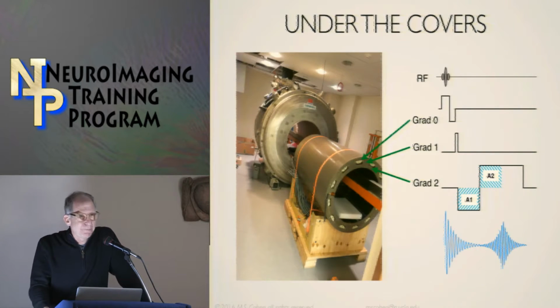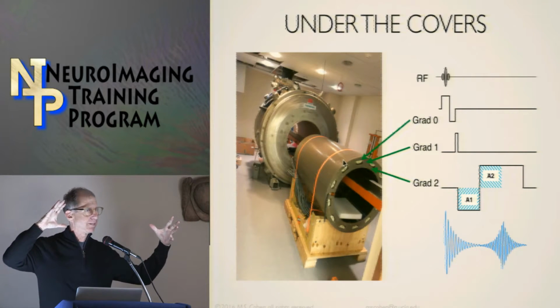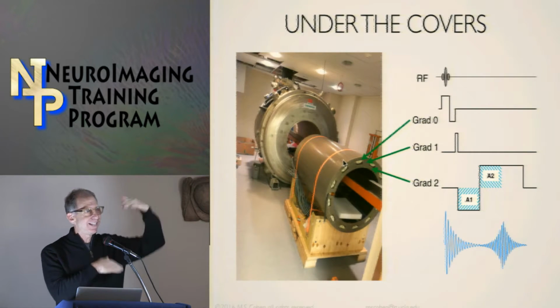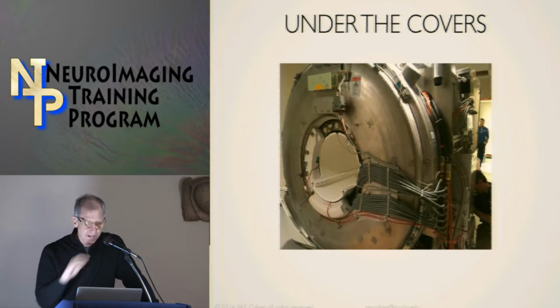Then start peeling things apart a little further, and you can see the actual magnetic resonance imaging field gradients, which are these giant coils of wire made to make the field vary with position. They're wound concentrically, X on the inside, then Y, and then Z on here, in layers. These are the portions of the equipment which play out these features of the pulse sequences.